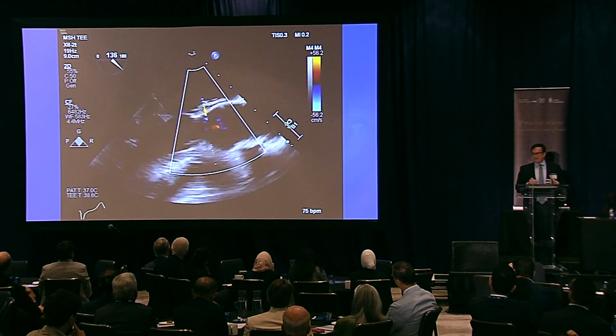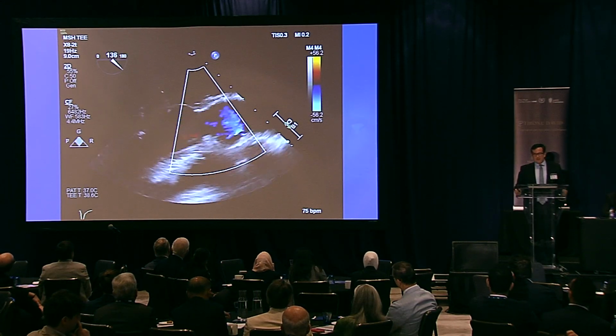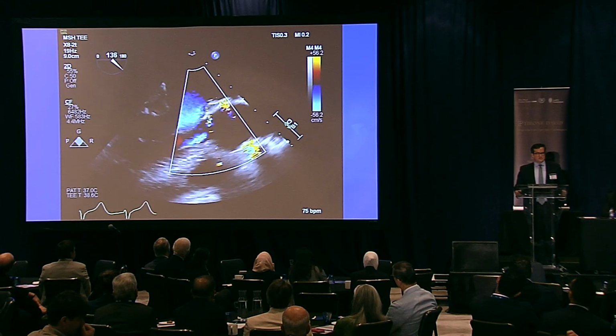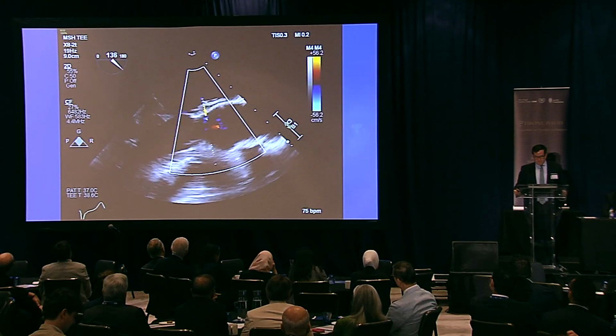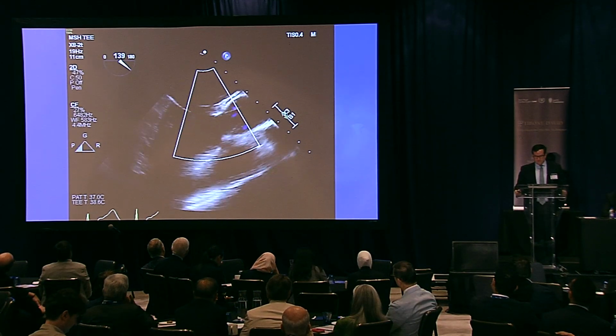Everything kind of settles in. It gets better. Still not a great jet. We're not happy with that. This is maybe 5-10 minutes. We're still looking at it and just evaluating where it's coming from and what's happening. And then you wait. This is about 15-20 minutes later.